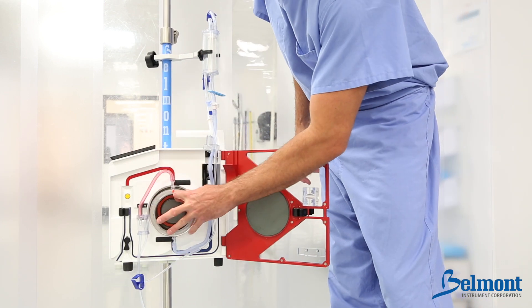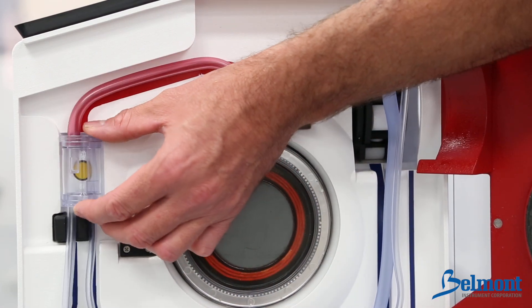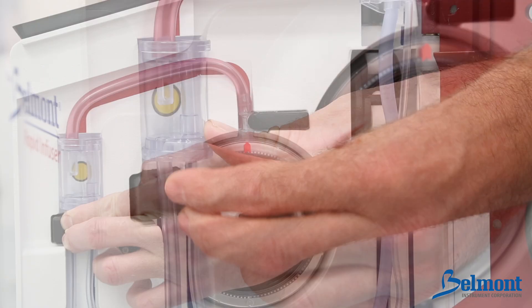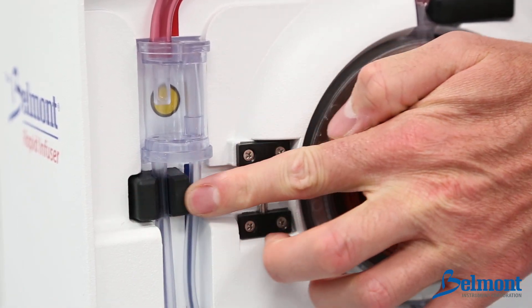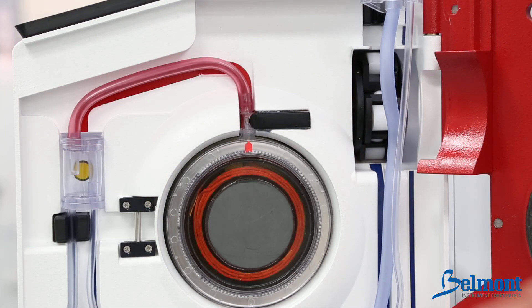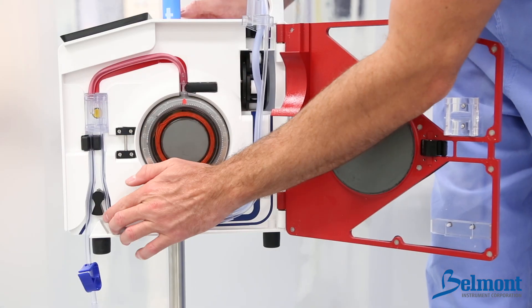Insert the heat exchanger with the red arrow pointing up. Align the red tubing on top of the red stripe and place the pressure chamber into the pressure channel. Press the infuse line into the secondary air detector to the left of the patient safety valve wand. Note: the infuse line should be at or below flush within the air detector. Place the thinner recirculation line to the right of the air detector and to the right of the valve wand.